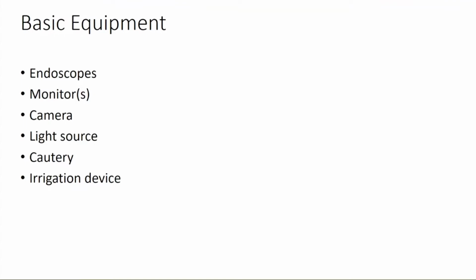You need a monitor to visualize what you're seeing. You need a camera to actually capture the images. You need a light source to visualize what you're seeing. Cautery is not necessarily needed for an ETV, but you should always have it on hand, because if you have bleeding, it's helpful.